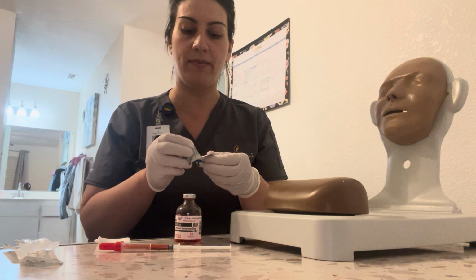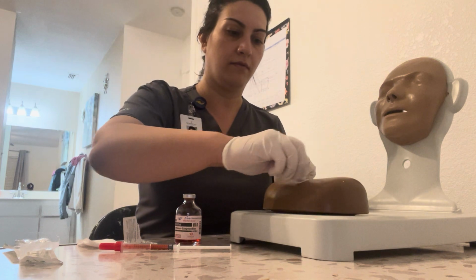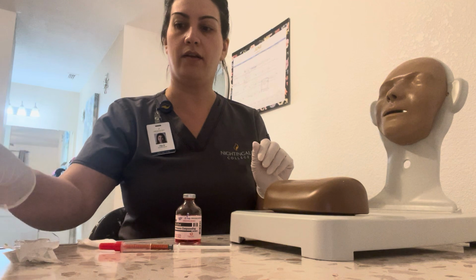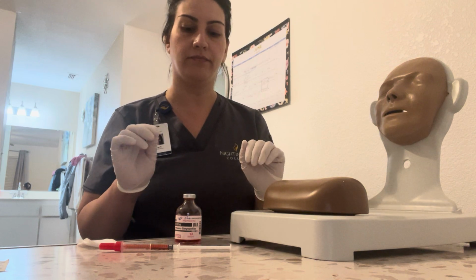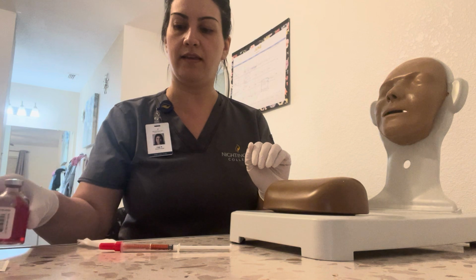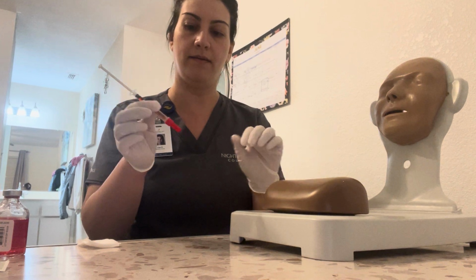Next, we want to go ahead and take our alcohol wipe here. We're going to start from the center, going outwards 2 inches out. We're going to have that air dry over here. I'll discard that. Air dry, and we're not going to touch that area. Next, we're going to go ahead and start with the injection. We're going to grab that. That is all air dried.